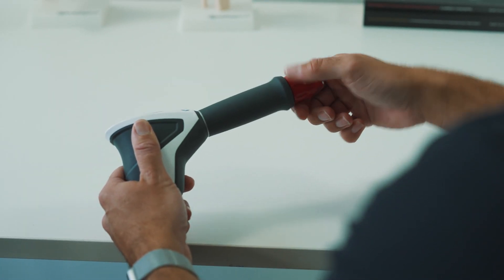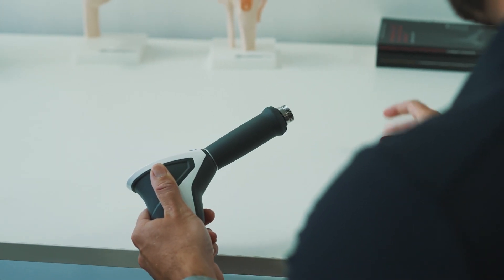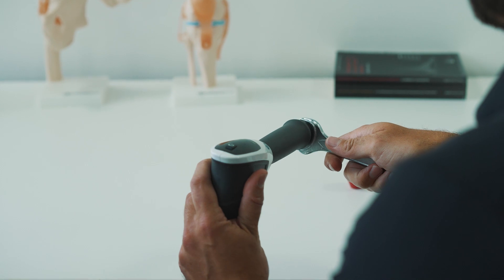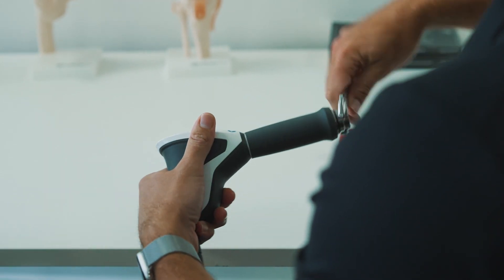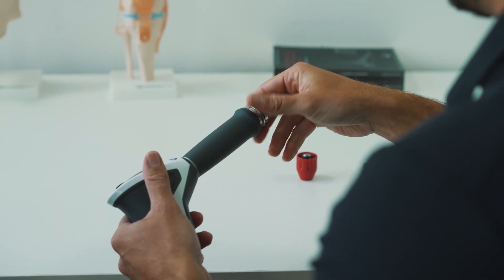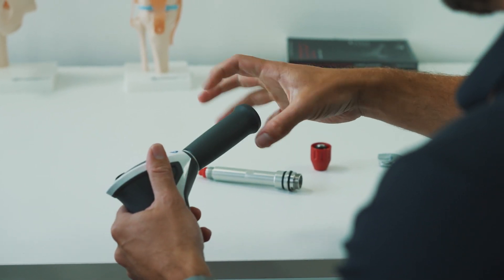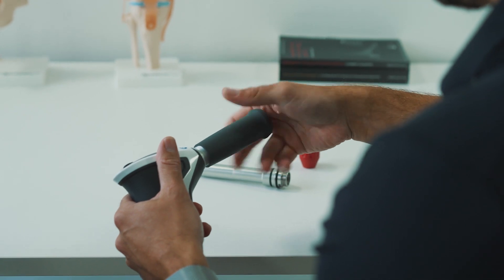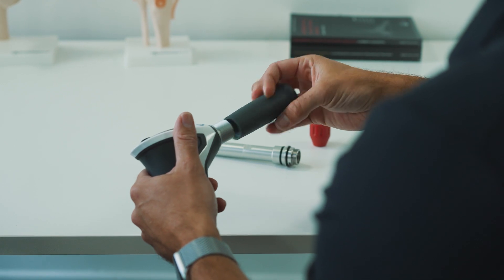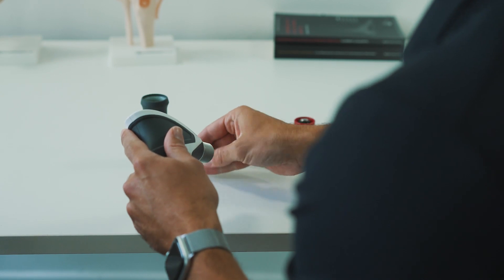Firstly, remove the transmitter. Then, using your spanner, remove the barrel. Place this to one side and remove the grip. Tap the handpiece into your palm to remove the projectile and place it somewhere safe.